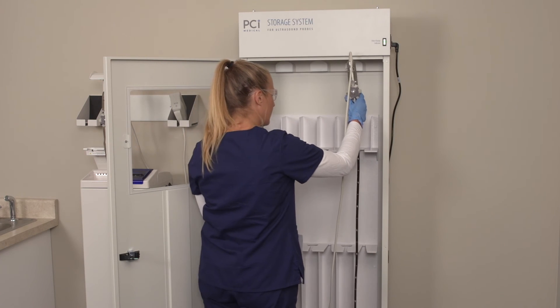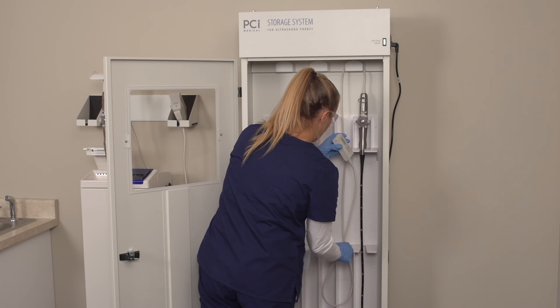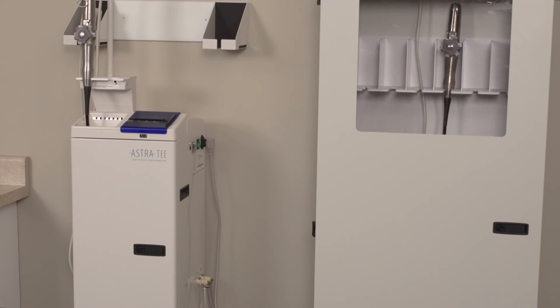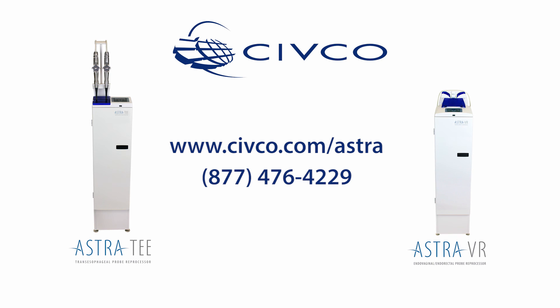When the disinfection cycle is complete, store your probe in a specialized storage cabinet from Civco Medical Solutions. Fast, easy to use, and improves workflow. Confident compliance. Standardized speed. Significant savings. Visit our website or call our disinfection specialists to learn more.